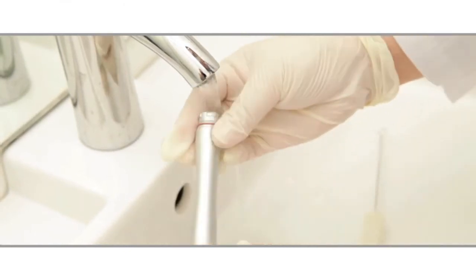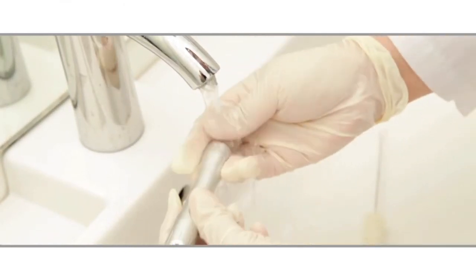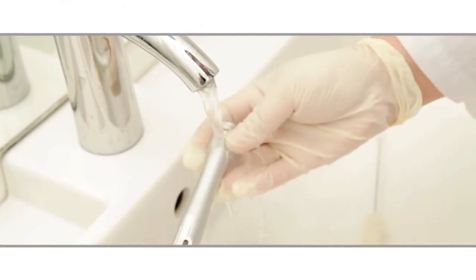Replace any o-ring showing visible damage or wear prior to sterilization to prevent any contamination. To sterilize, place the bagged outer sheath and rear cap in the sterilizer, ensuring that the bag does not overlap with any other instruments.